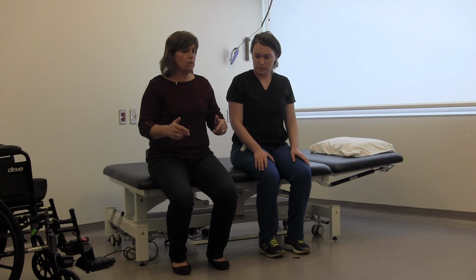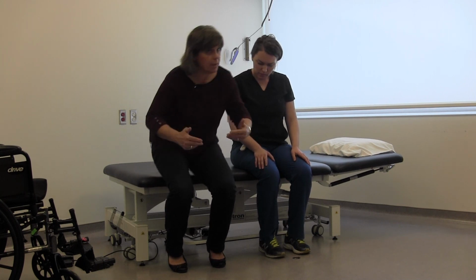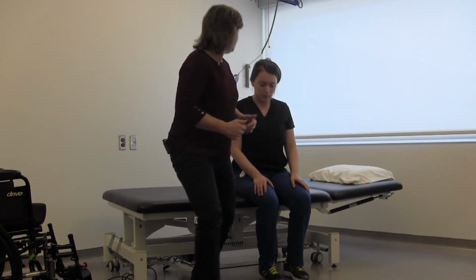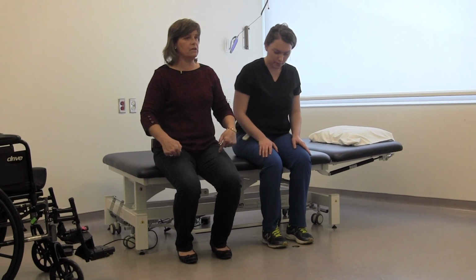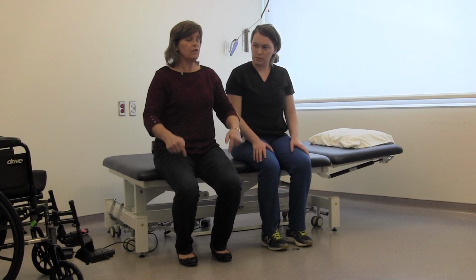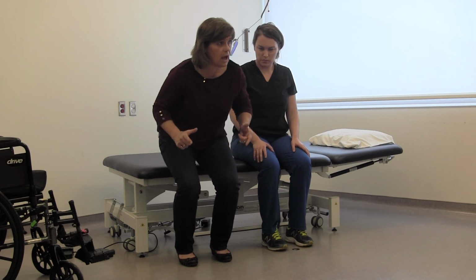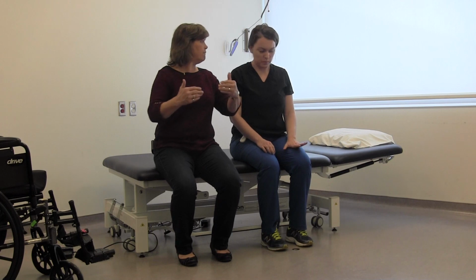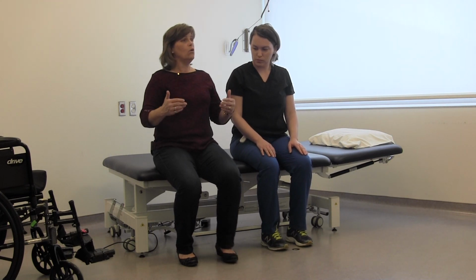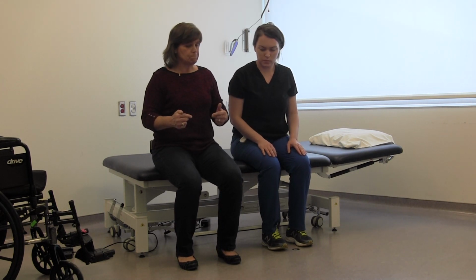Okay. If you don't have a good base of support, or if their heels are off and on their toes, when they come up, they're just going to shove them forward, right? So you want to get them to the edge, and then you want to get their feet tucked back as far as you can. The closer their feet are to the hips, the less weight shift that they have to do to stand up. And it's that weight shift that scares them, right? Our patients are afraid of falling forward. So they don't actually complete that full weight shift. So we have to make it easy for them to complete it. Okay?